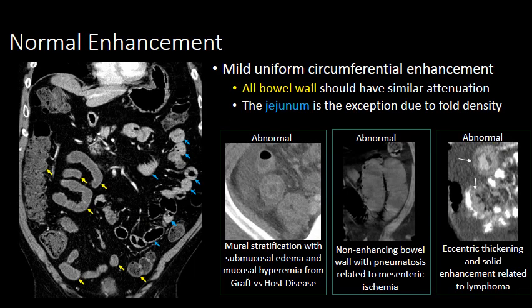When thinking about normal enhancement patterns of the small bowel, we want to see uniform circumferential enhancement. All of the bowel wall should have similar attenuation, except for the jejunum, which often appears thicker and more hyper-enhancing — again due to its high fold density.